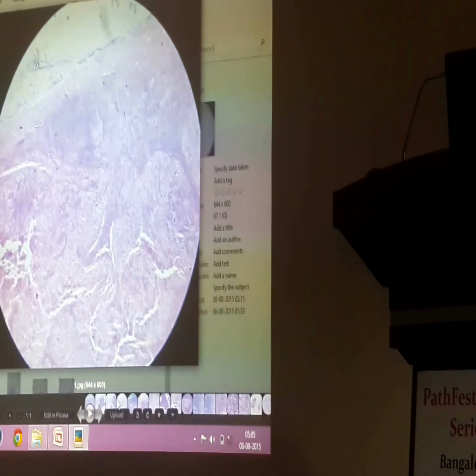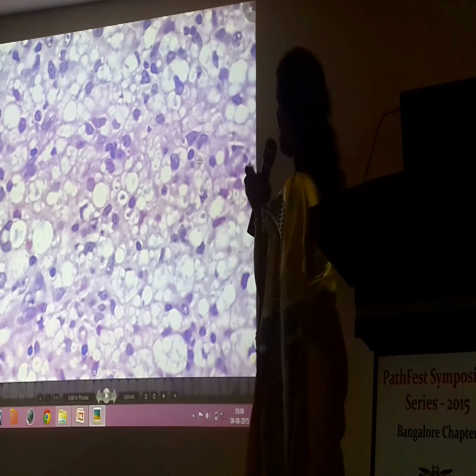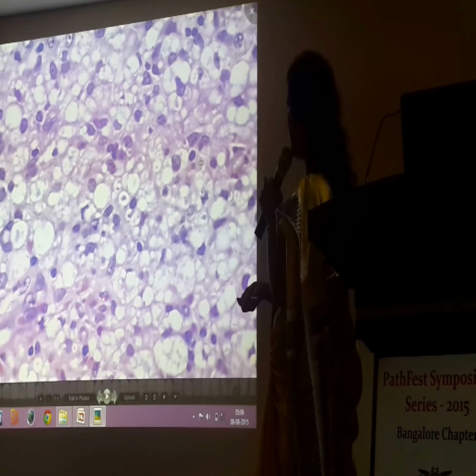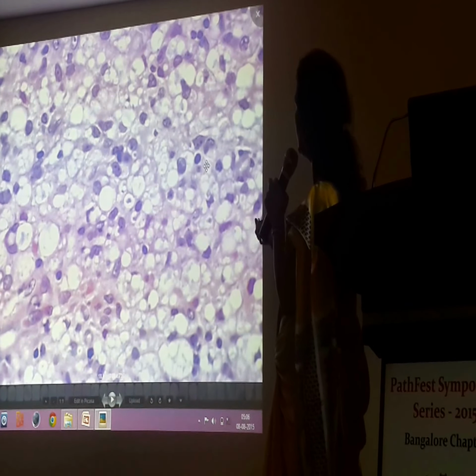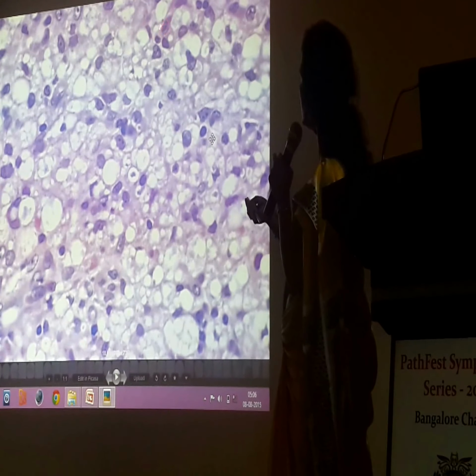This is only to show you a better morphology. Can you appreciate them now? You need to look at these histiocytes. They're telling you that I am so familiar, you keep seeing me somewhere routinely. The epithelioid cells, where are epithelioid cells? This one? No, these are macrophages, right? This is an epithelioid cell.